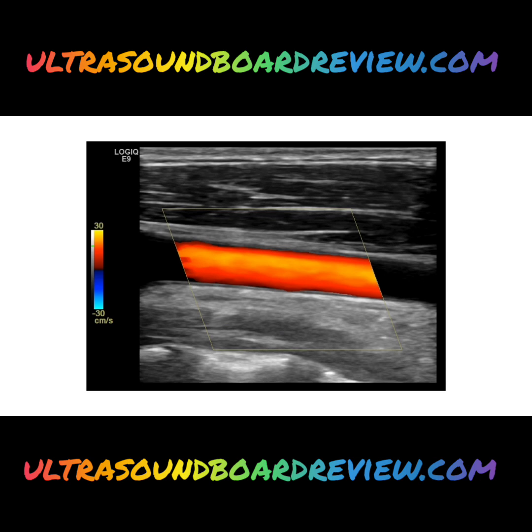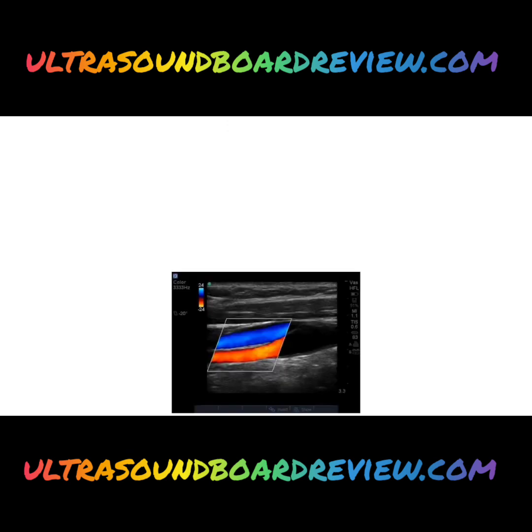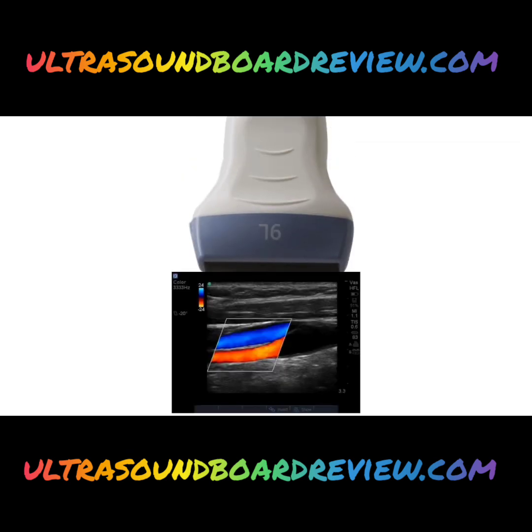And here's everything put together. So red corresponds to the top of our color bar. Oh, and if you forgot, the top of the color bar means flow is traveling towards your transducer. So, okay, that's all good, right? But where is your transducer? Well, if you remember using a curved probe, it is right here, but we're not using a curved probe. We're using a linear probe. So our transducer is here.